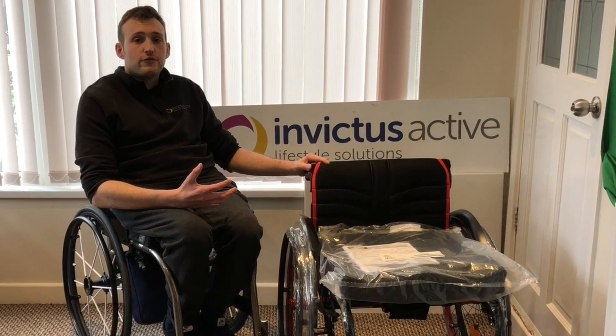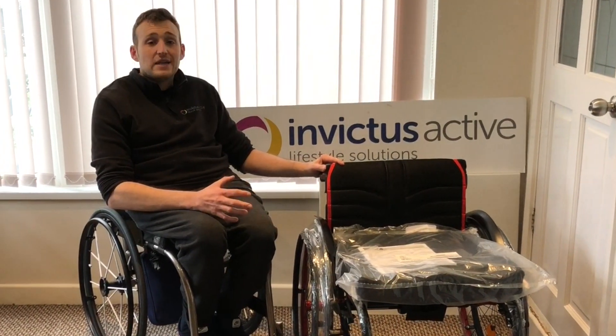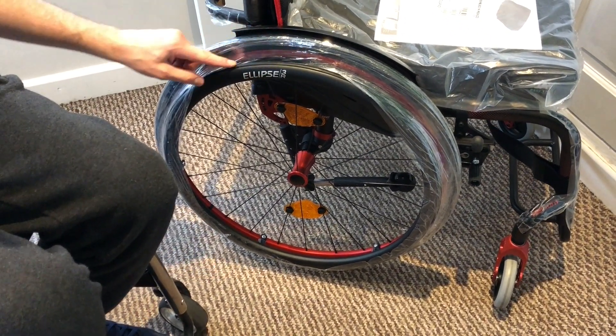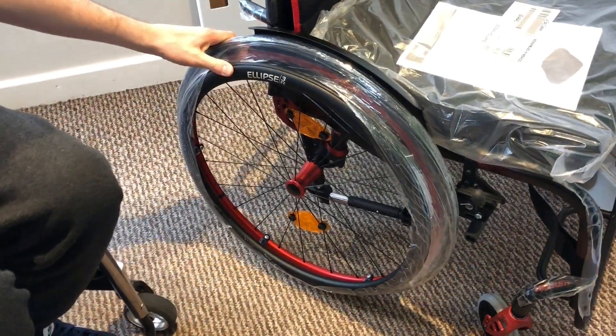When you're looking at the order form and we're speaking to you about the options, this gives you a little taste for what's available with the Quickie Helium. So this is the Ellipse 3R — it's got a rim on the push rim so it does offer some extra grip.